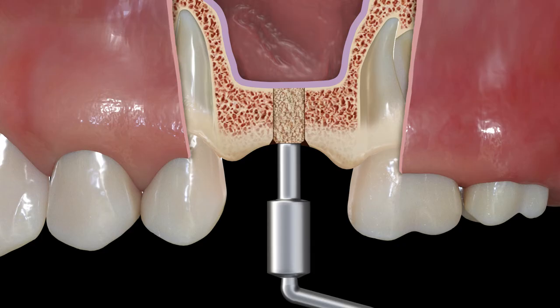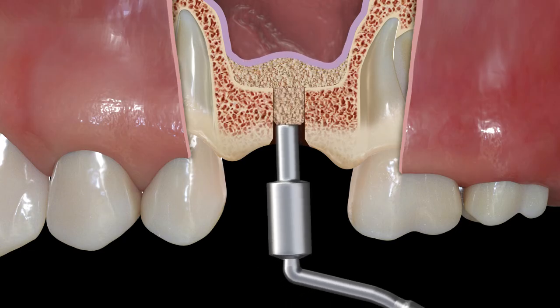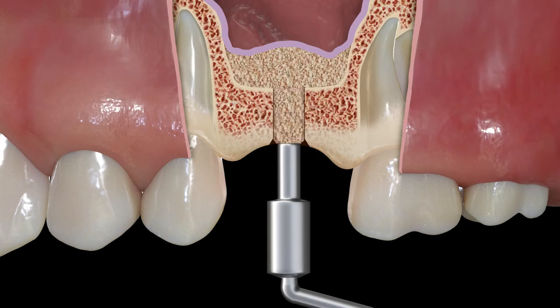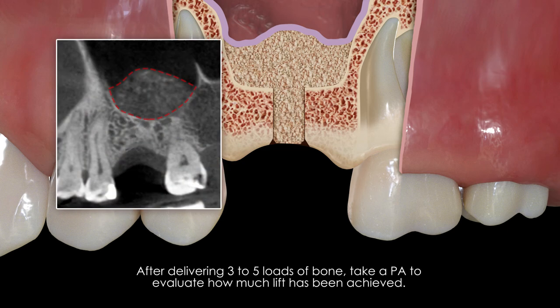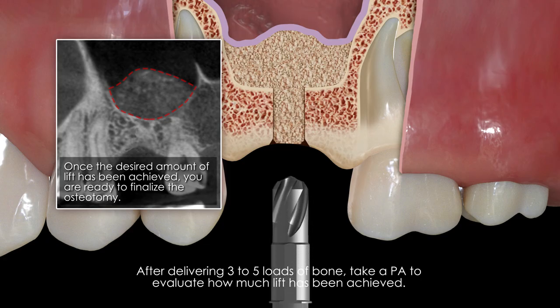Now you can begin lifting the membrane. Since patency was achieved with the 6 millimeter long drill, the corresponding 6 millimeter long graft packers should be used to condense the graft. Remove the guide and begin placing graft material into the osteotomy with the graft carrier. Use a gentle wobbling motion to condense the graft until the depth stop on the condenser bottoms out on the crestal bone. Continue loading and condensing graft material into the osteotomy. After placing three to five loads of graft material, a periapical x-ray should be taken to evaluate how much lift has been achieved.